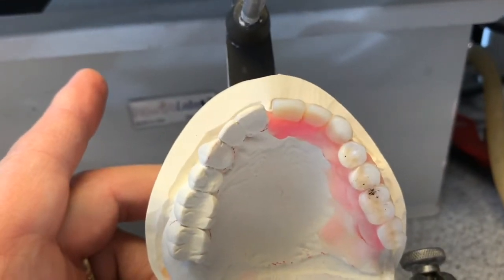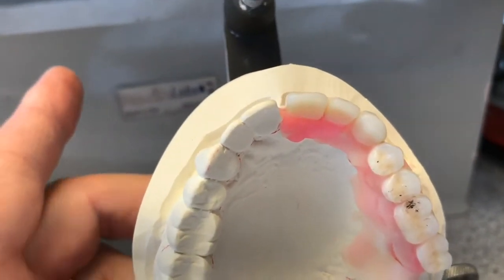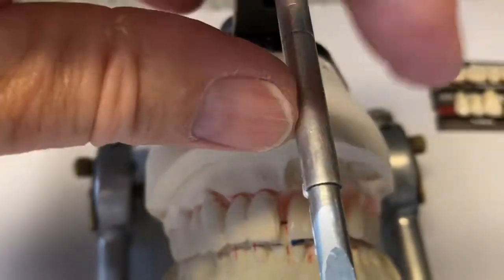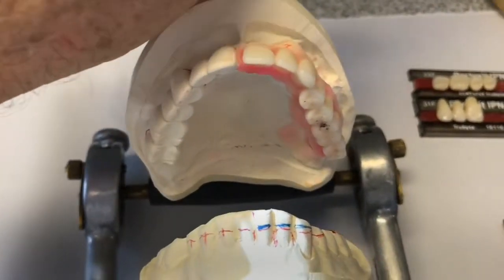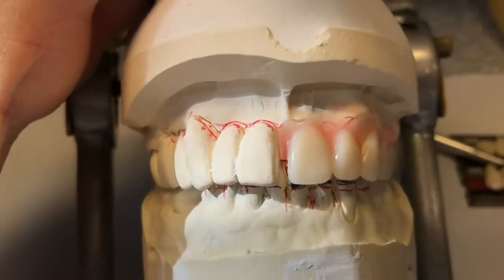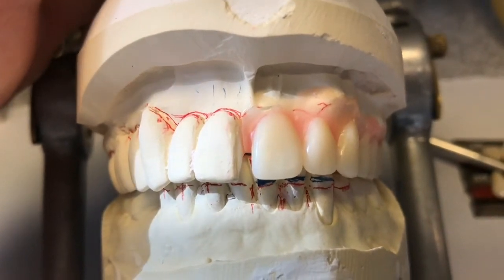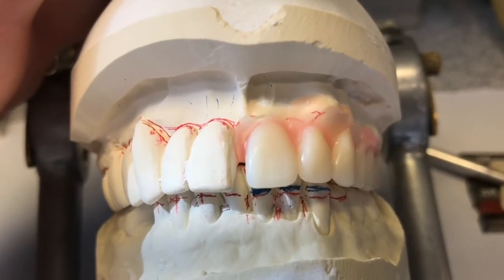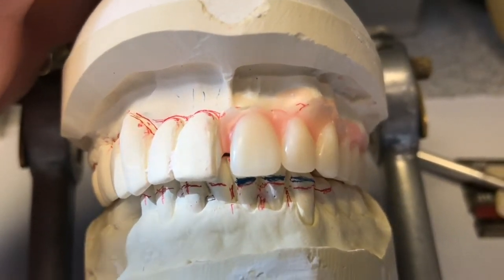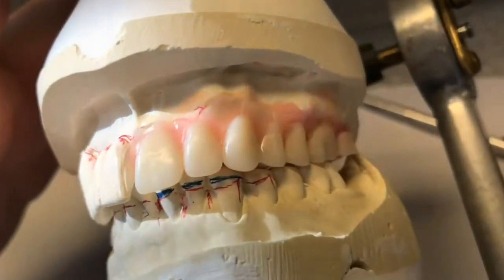I've corrected the midline, which is why my number nine is positioned over. That's our corrected midline. I'm maintaining the incisal length. I've also raised up the patient's left side a millimeter as requested by the doctor, because the bridge was a little canted on that side. So we're correcting for that.